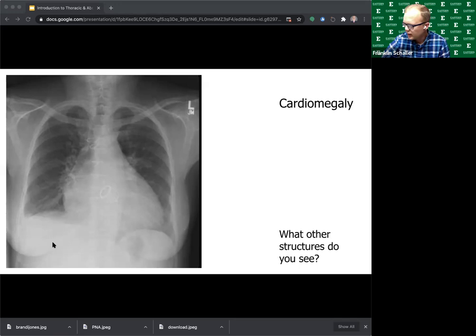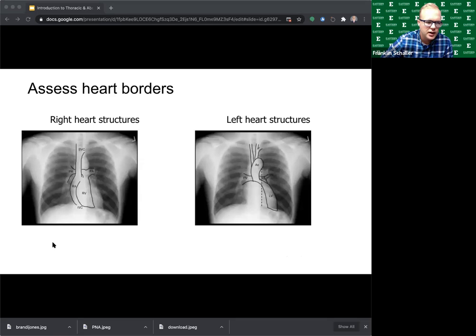All right, so we're getting some responses from everybody. Thank you. Tina says maybe a density in the left lower breast. Kendall says circular structures mid chest. Kind of looks like a marshmallow or something there. Something on the aorta, a clip or a metal ring, says Kristen. Implants, says Camille. So what I see on this chest x-ray, right in the mid chest there along the mediastinum, that is actually an old mitral valve repair. So what you guys see there is a mitral valve. Good pickup, guys. You guys are already getting so good at chest x-ray interpretation.